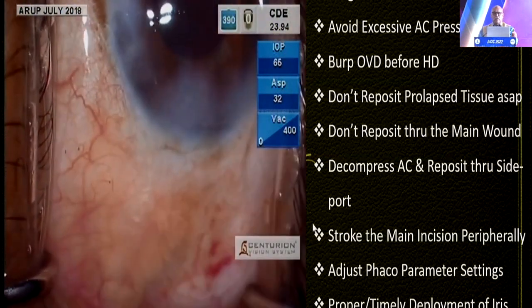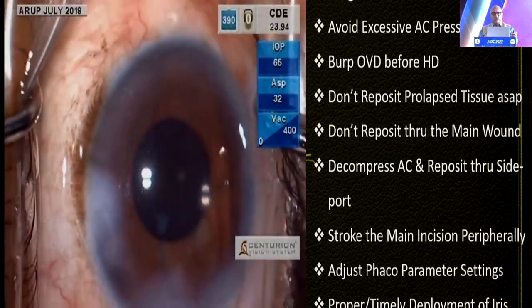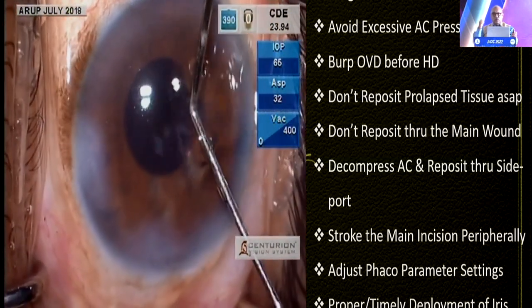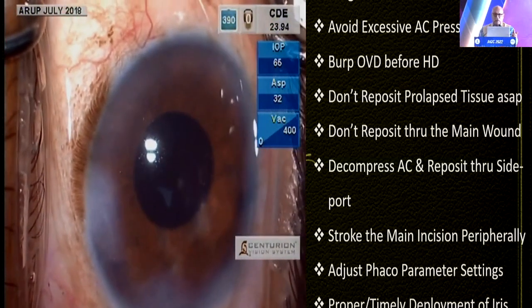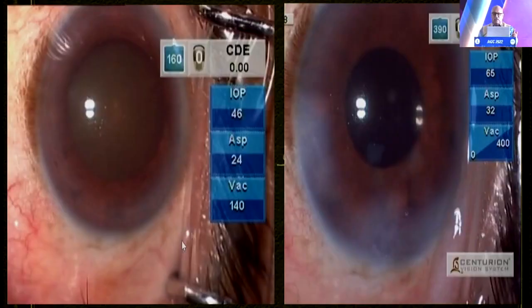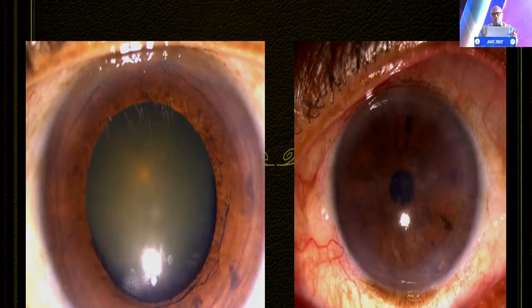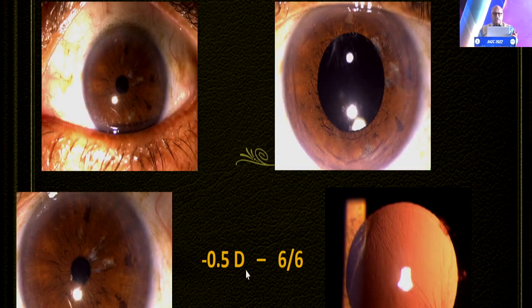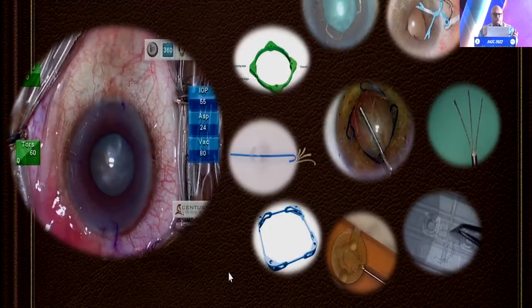Good stromal hydration was done. If you feel you need to do a lot of stromal hydration, it is better to put a suture — at the main incision or sometimes even the side port — though in this case it was not necessary. The patient had a one-week post-operative vision of 6/6 without correction and continues to do well.